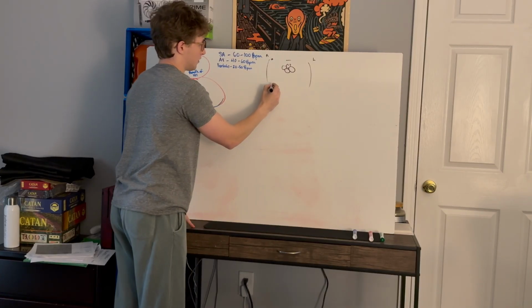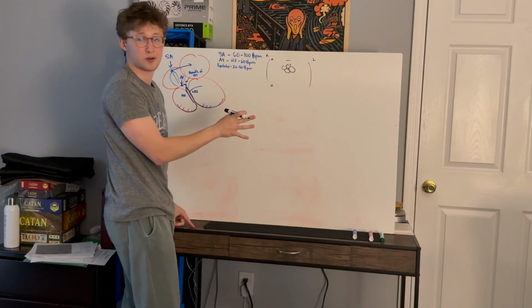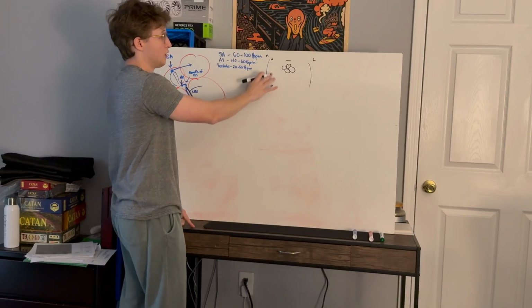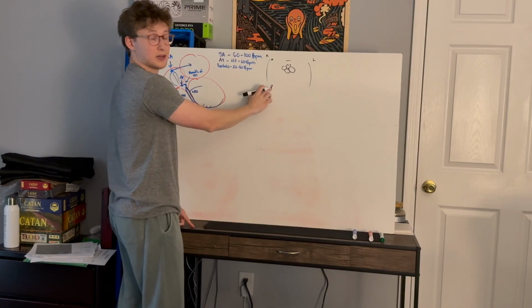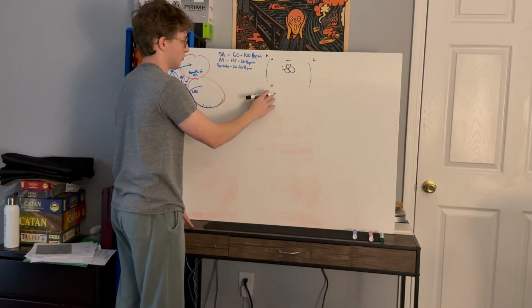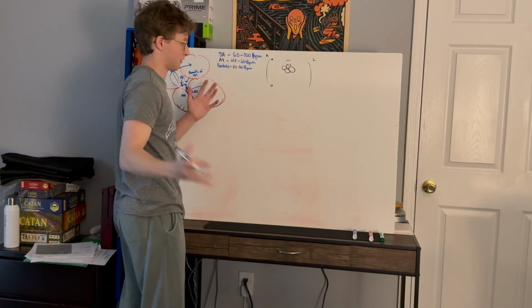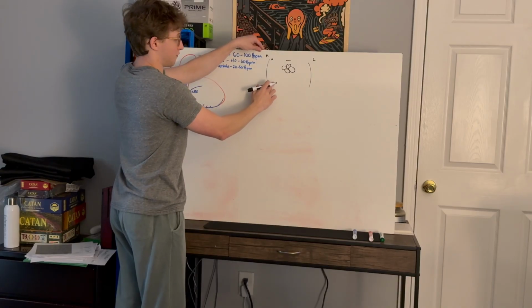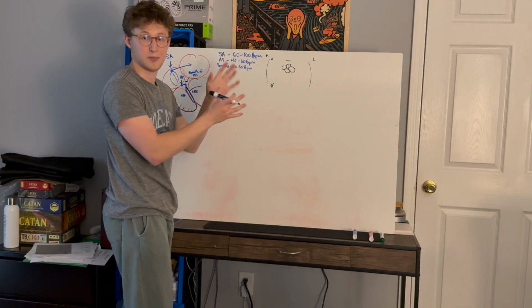Right arm, right leg. Right leg is a grounding lead. It's not used for making electrode. Right arm electrode, right leg electrode. This one's really not important. It's a grounding electrode just to get rid of any sort of artifact from movement in the body if they're adjusting or whatever. So I'm just going to put an X over it for our sake. It does not contribute to making 12 leads.